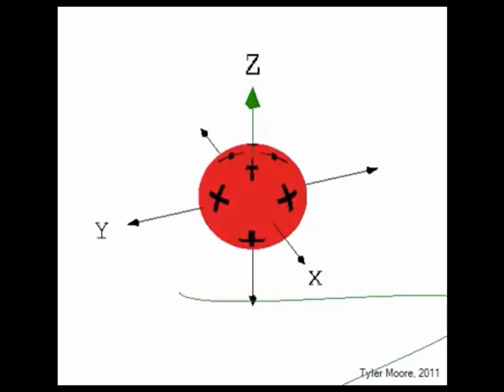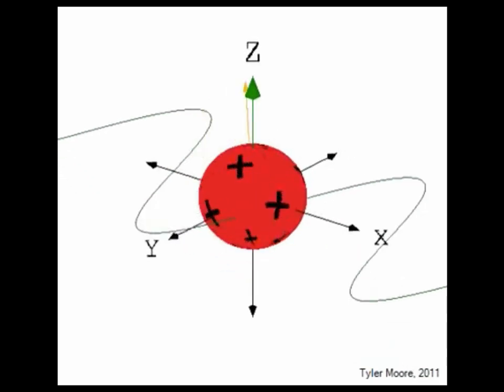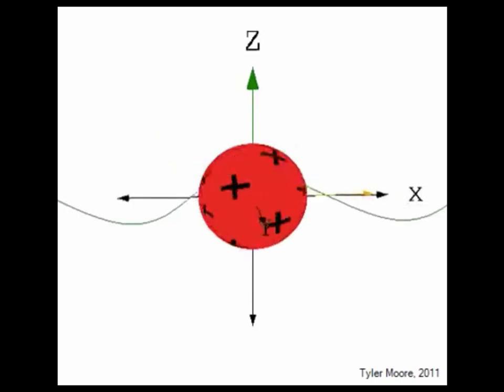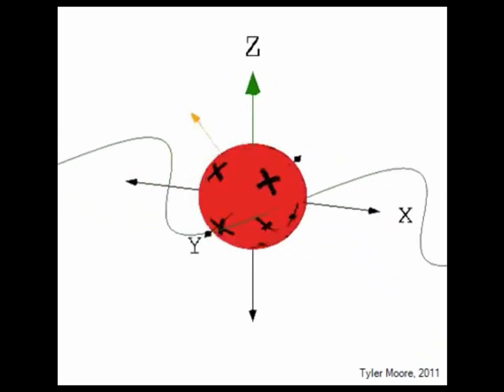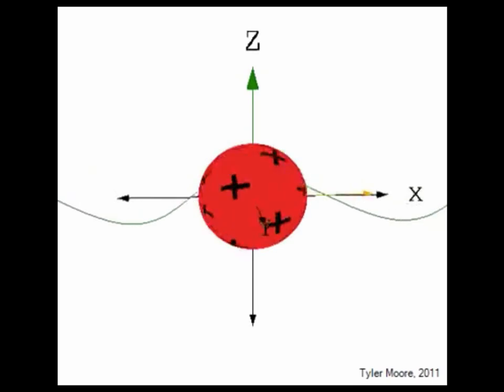So you can see here, if we apply a wave at the same rate that this is turning around, you can actually change the orientation of the spin, and hence its relative orientation in the main magnetic field. And the thing to keep in mind here is watch where this is versus where you are on the sine wave. Play that again. So you can see approximately when you hit a peak here, the tip is pointing off, say, along negative y. So do people kind of see this, get this?